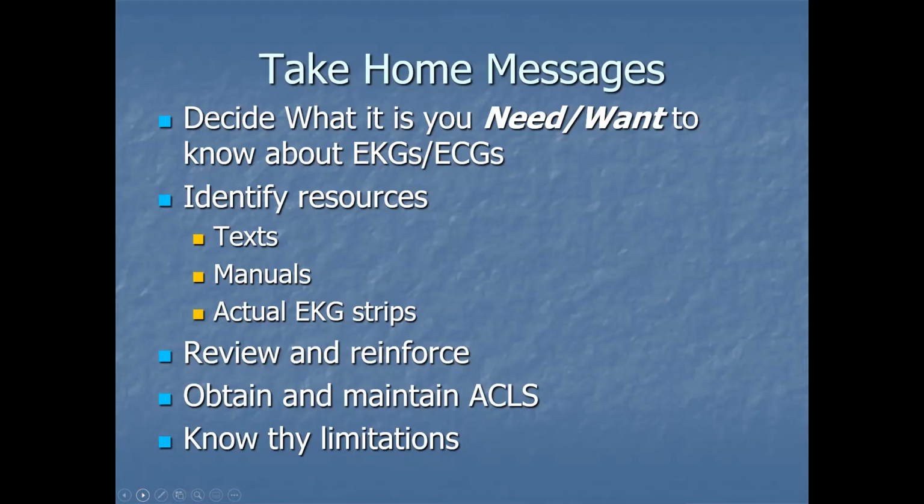Know your limitations. If you have questions, you're looking at a rhythm that you don't understand, or the patient's monitor is alarming and you're really not sure, you just ask for help. Hey, could you come in the room with me? I'm looking at a patient, they're not unconscious, but they don't look quite right. Can we do this together? Knowing that it may be a code blue, it may be a rapid response, or it may just be a lead fell off and the patient just happens to be having a bad moment otherwise.